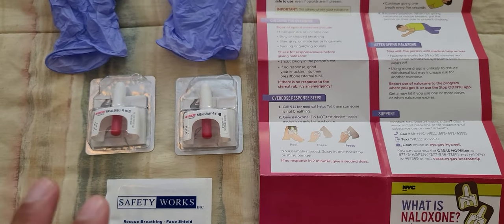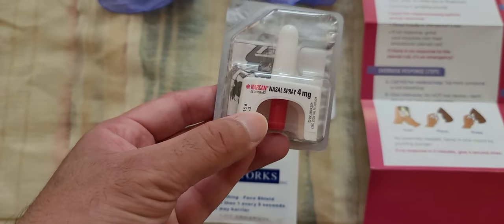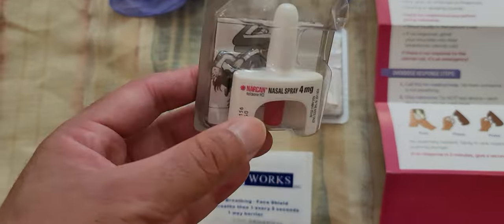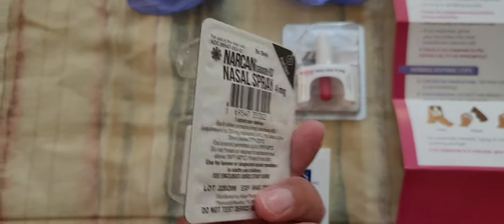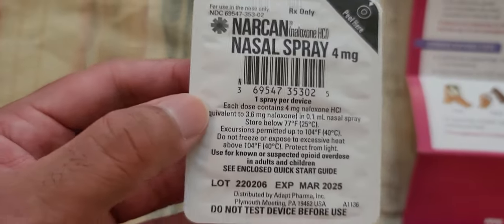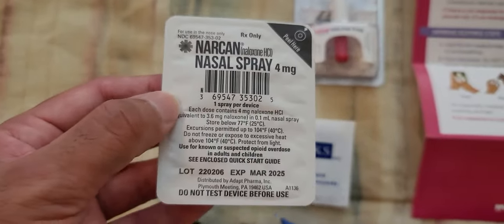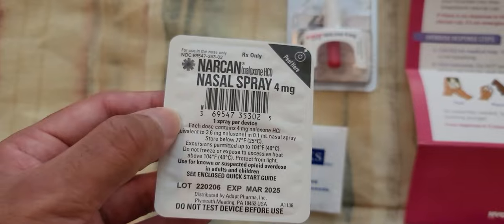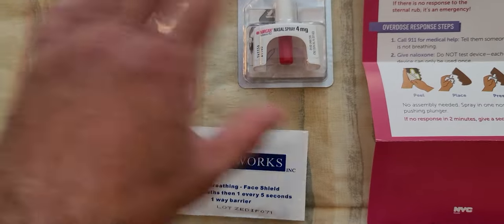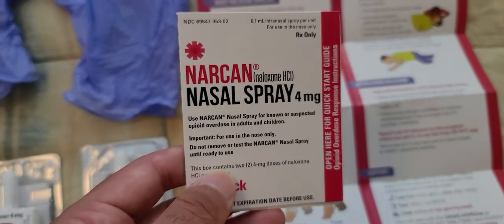This is the nasal spray, and as you can see it's very small. On the back it says one spray per device — that means you need to use it immediately to save the person. They give you two doses, which is good, and you also get gloves, which are very important.